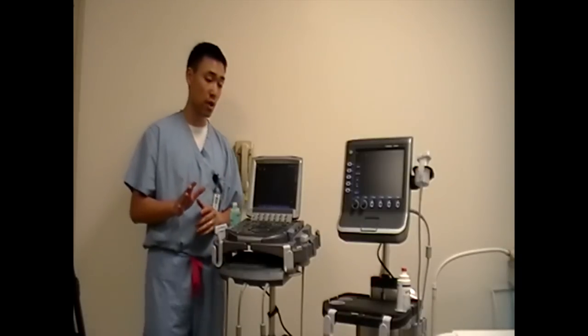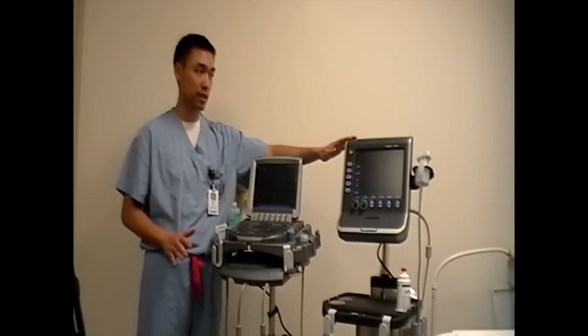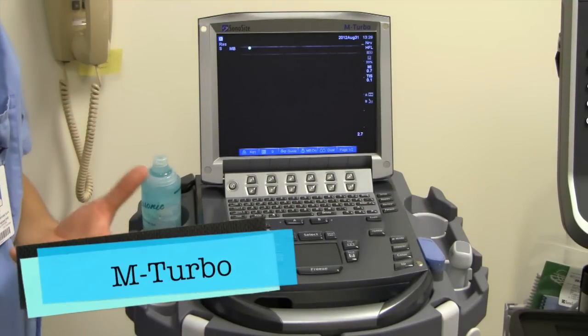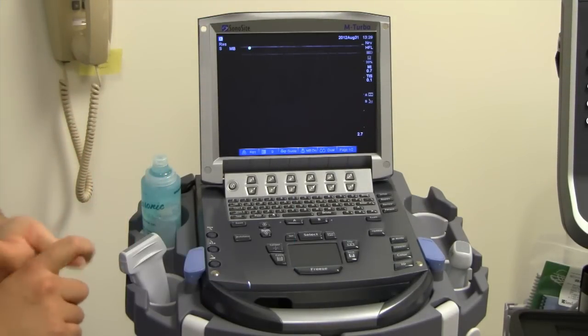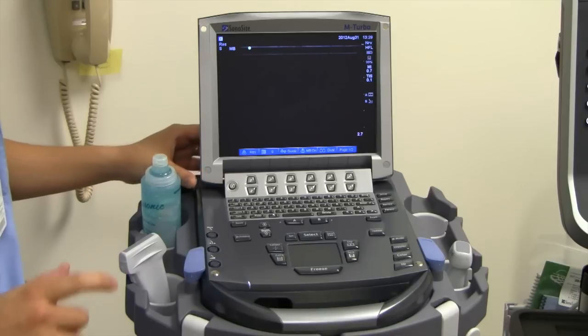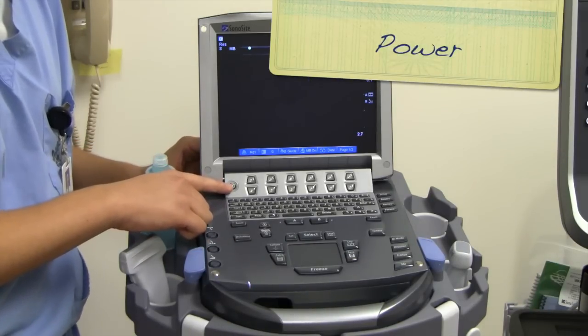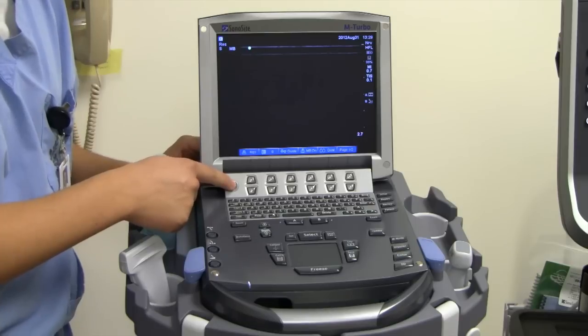The five things I want you guys to know — we're going to start with the M-Turbo machine first, and then we'll go over to the S-Fast machine. So the very first thing, as with all appliances or anything else, is you have to know how to turn on the machine. The power button for the M-Turbo is in the top right-hand corner right here. You push it, it turns it off and on.